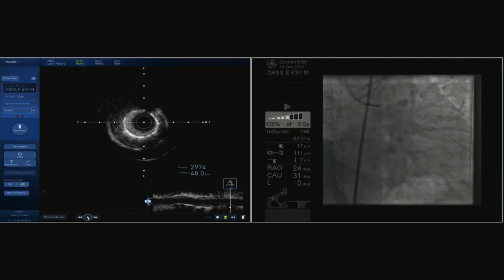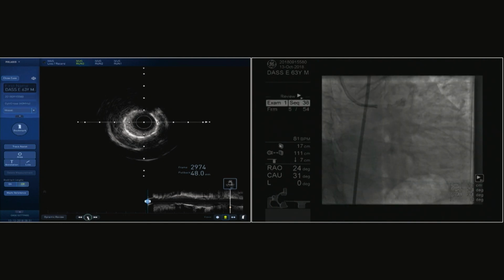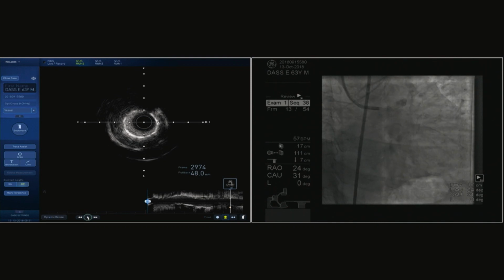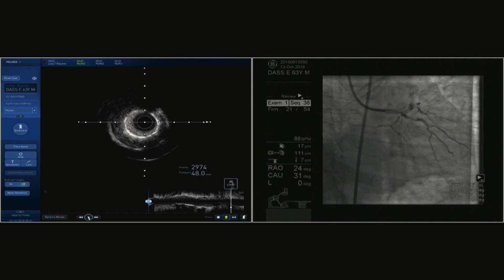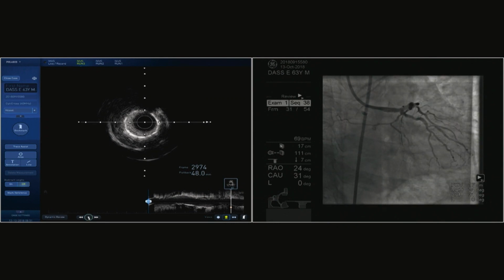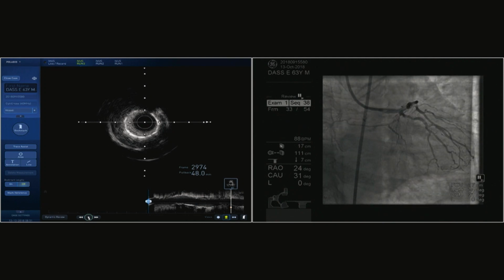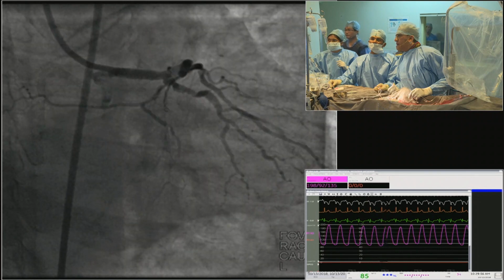I would just like you, Kirti and Dr. Hirohata, to comment, because this left main stent, for everybody's understanding, is very important, including my understanding of these IVUS findings. I interpret these IVUS findings as an under-expanded stent. Maybe I'm wrong, but I would not be accepting this in my lab and I may want to be better educated. Why don't we have a discussion on this, which part of the left main you think is underexpanded?